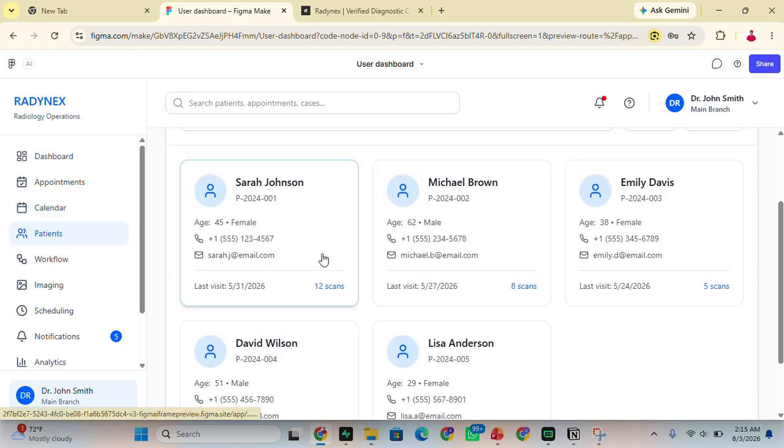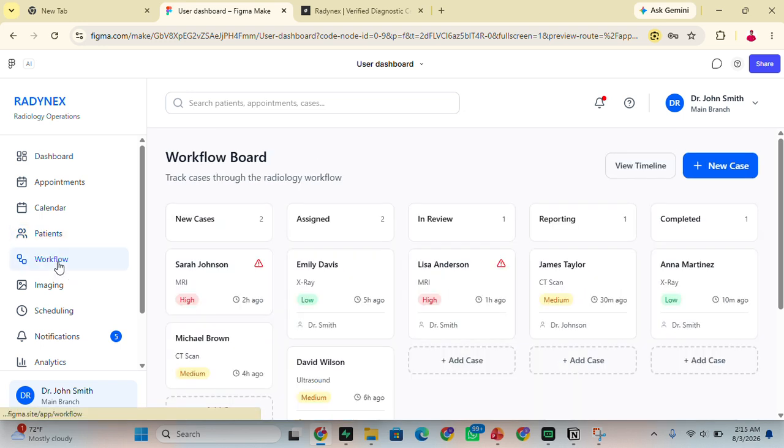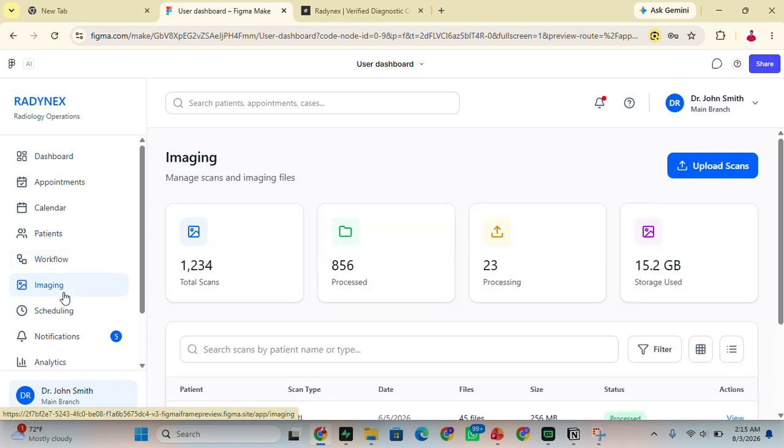This is the patient, all your patient that you have in your diagnostic centers. It's here. So the imaging, this is AI. You can use AI to analyze images faster, helping radiologists, reducing the cost of time. According to our research, millions of hours are being used in analyzing scanning images every year.